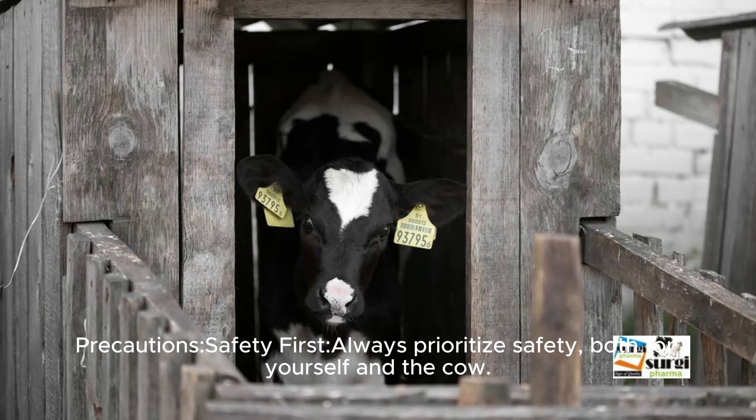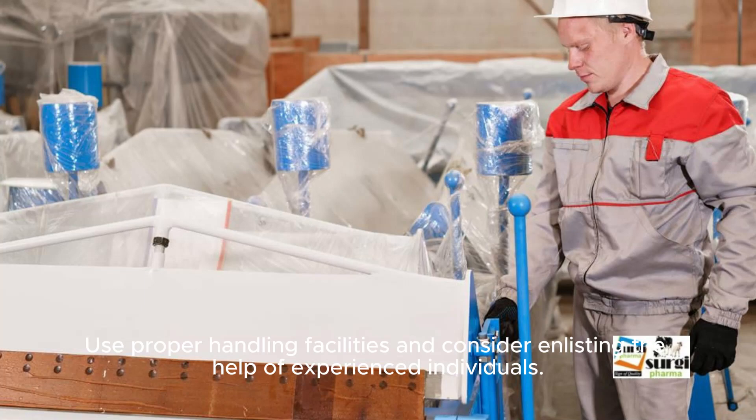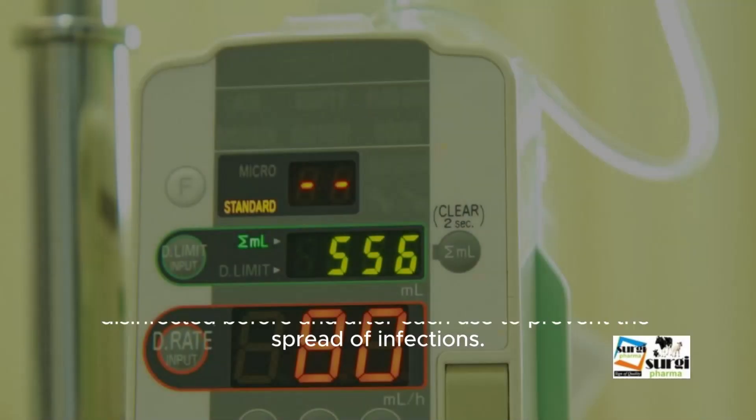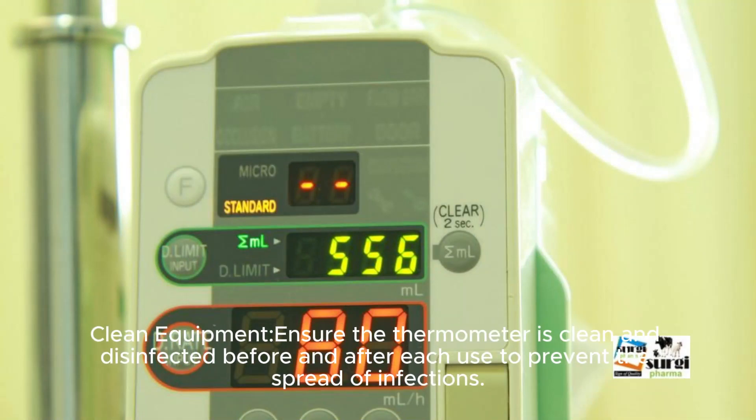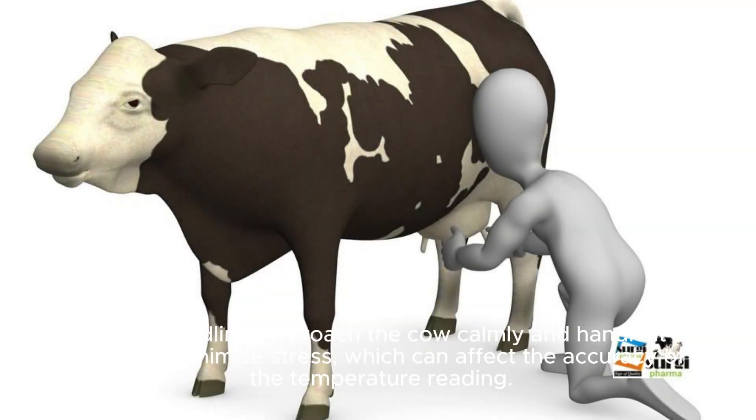Precautions: Safety first — always prioritize safety, both for yourself and the cow. Use proper handling facilities and consider enlisting the help of experienced individuals. Ensure the thermometer is clean and disinfected before and after each use to prevent the spread of infections. Approach the cow calmly and handle it gently to minimize stress, which can affect the accuracy of the temperature reading.